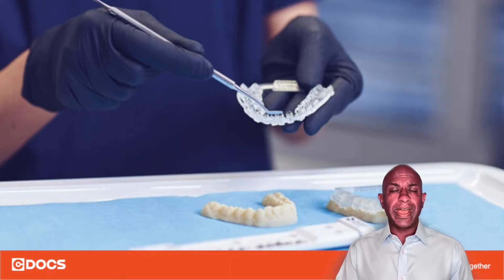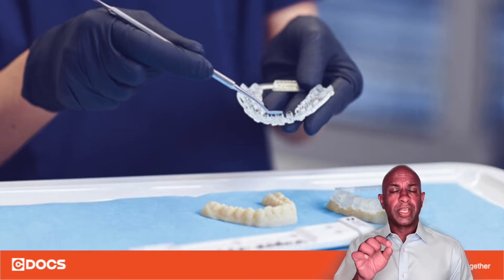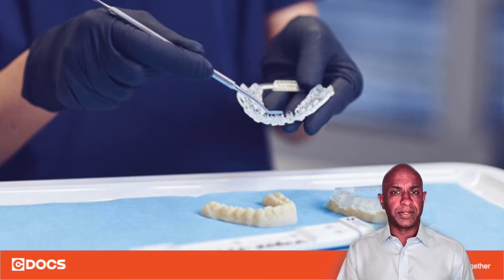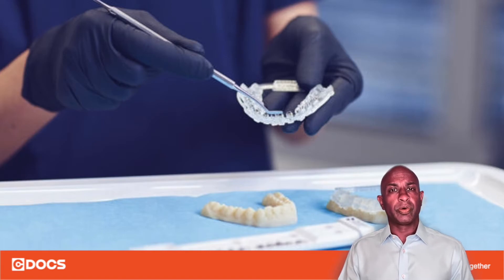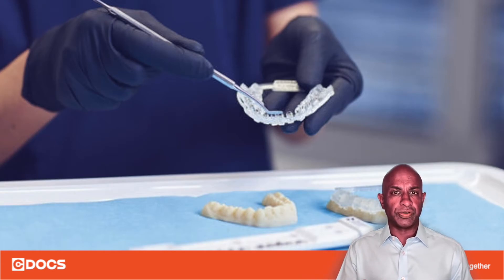When you load that well you want to make sure that you keep the tip of that syringe inside the composite the entire time. Just like when you're loading PVS into the PVS impression tray, you want to ensure that the tip stays submerged, because if it comes out then you may inadvertently introduce air bubbles.